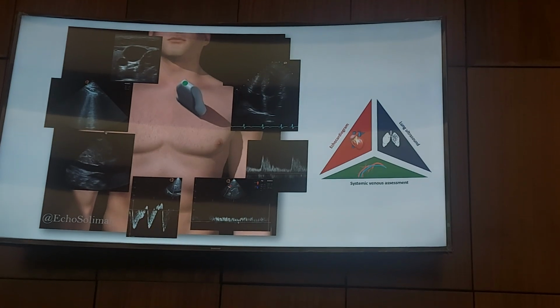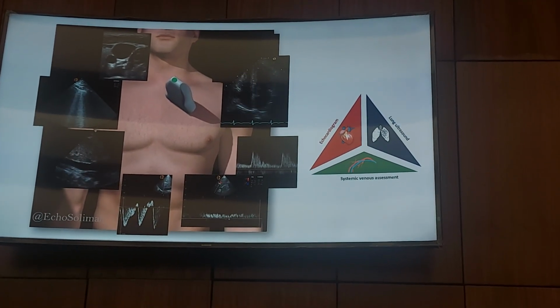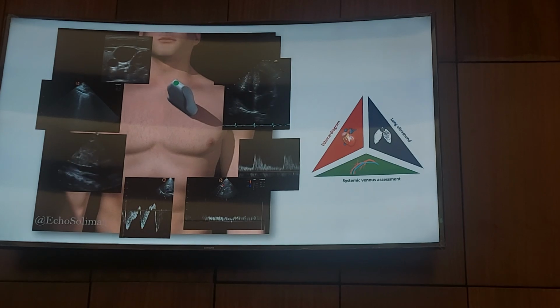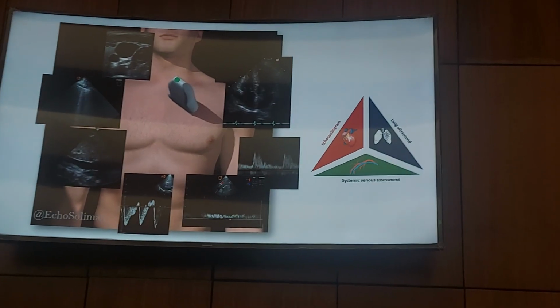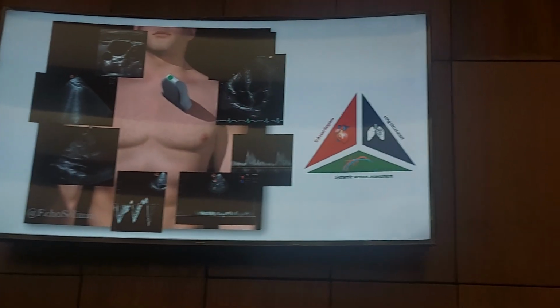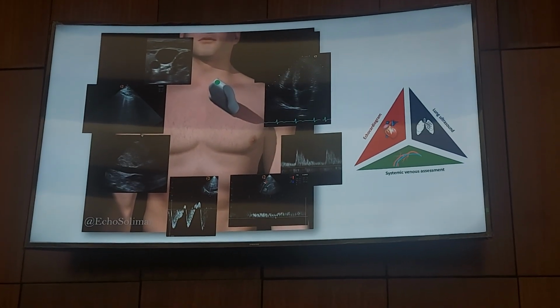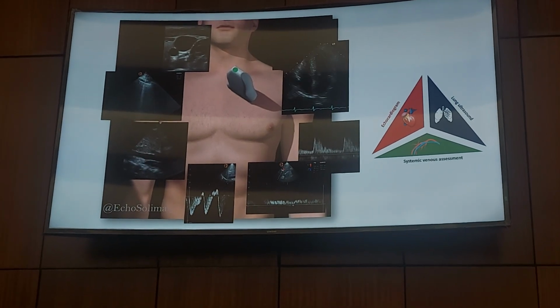Yes. Very good. Any other question before we do the hands-on? Captain, I want to make use of your experience in your center. How can ultrasound help us to confirm post-cardiac surgery vasoplegia? Great question, because we see it a lot. Especially after a long bypass, you see patients coming with vasoplegia, not sepsis, just inflammation: very high vasopressor requirement, low systemic vascular resistance. The ultrasound evidence of vasoplegia is a hyperdynamic LV.